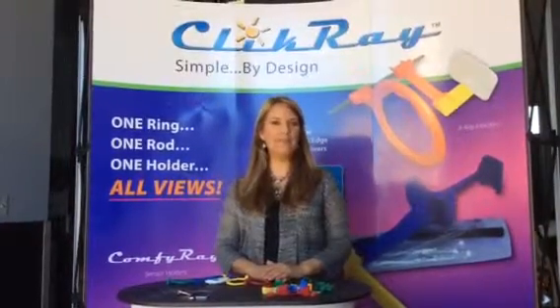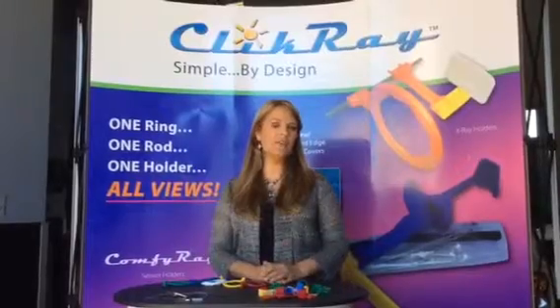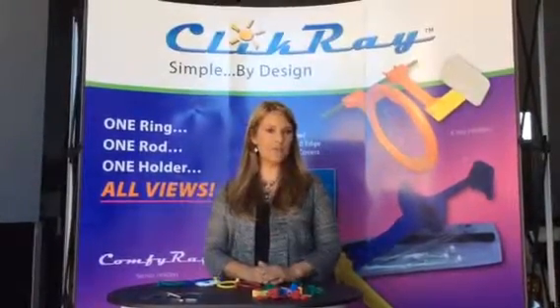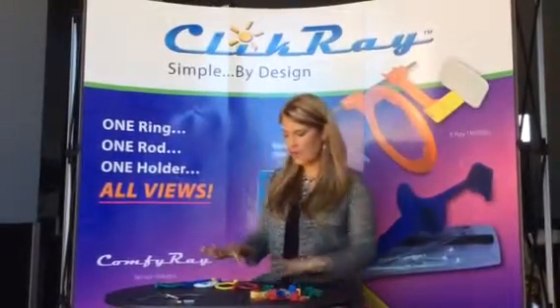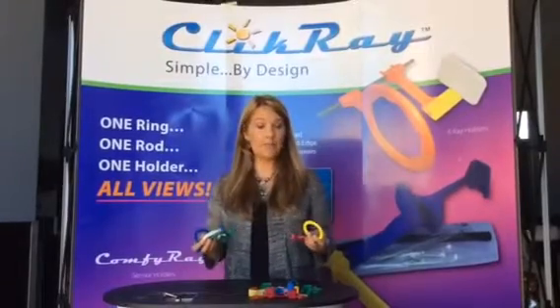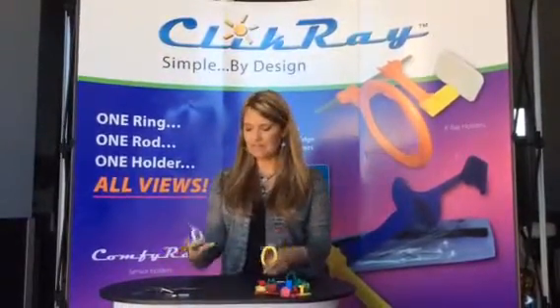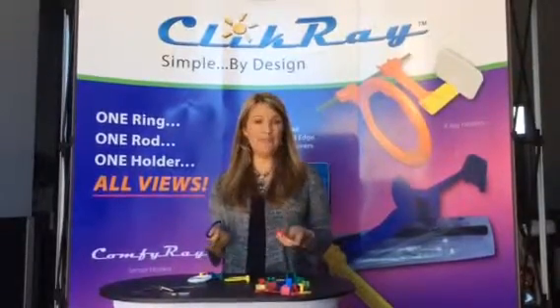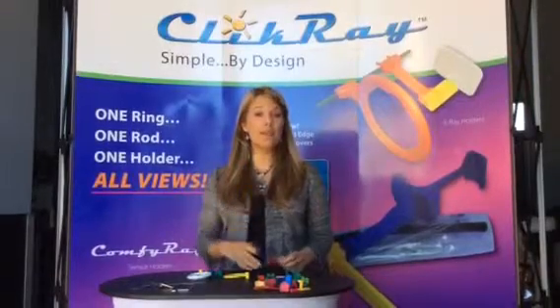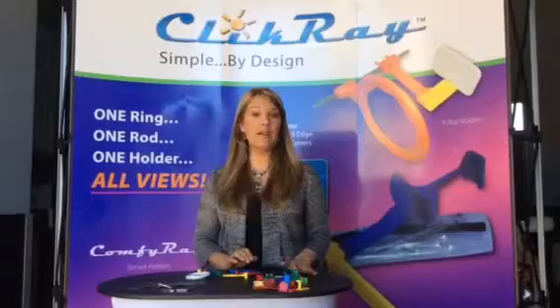Hi, my name is Susan Bateman and I'm here with ClickRay to talk to you and train you on how to use a new revolutionary design for sensor holders for the DEXUS system. If you're like most offices today, you have a system that looks a lot like this where you have tons of different rings, bite blocks, metal rods, and this is what you have to use in order to take a full mouth x-ray. Well, no more. We're here today to simplify the x-ray taking process and to make your lives a lot easier.